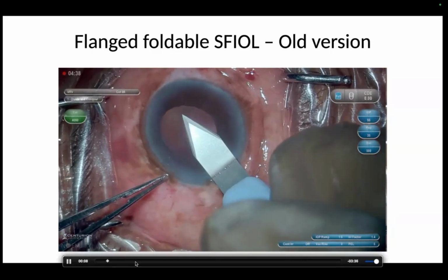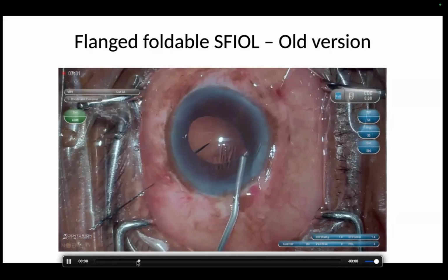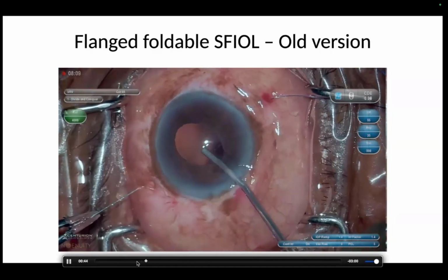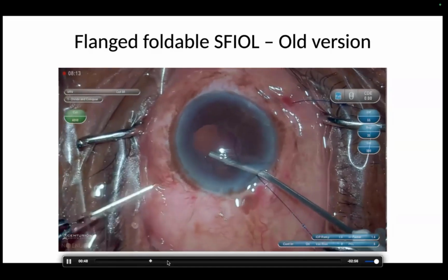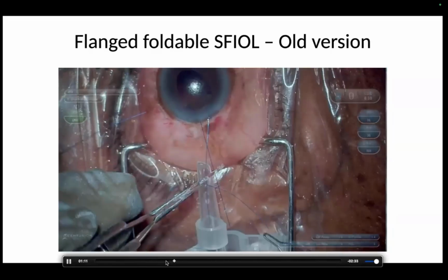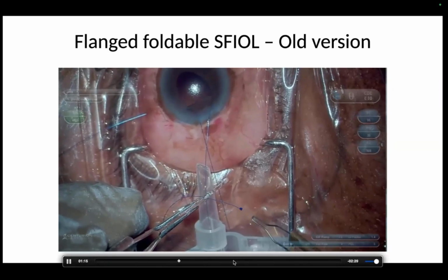I use a 3.2 mm keratome, make a large incision, and exactly parallel to the incision, I make 2 sclerotomies on either side in a similar fashion where you move the conjunctiva tenons, and the needle is taken out through the clear corneal incision. So it is passed through a cartridge, the butterfly cartridge, and punctured. This is very time consuming, and it's not that easy.